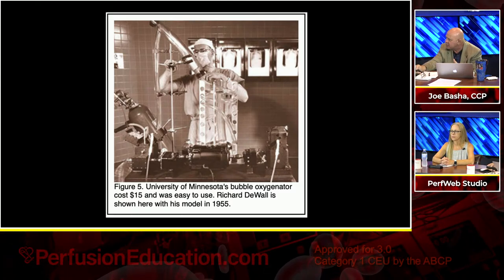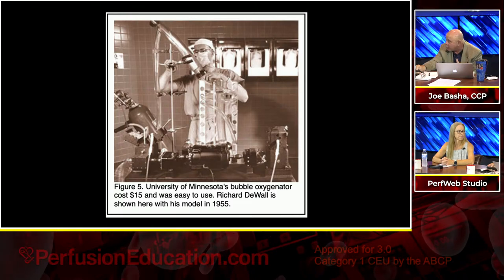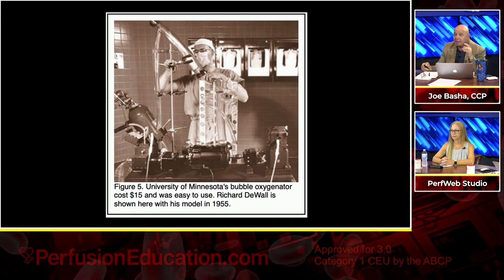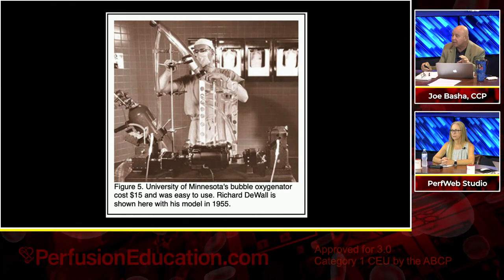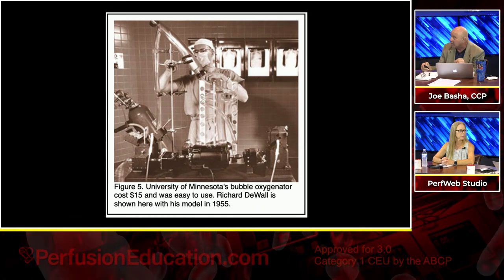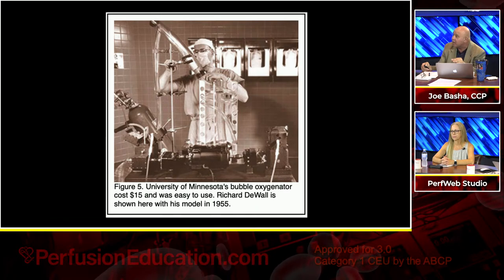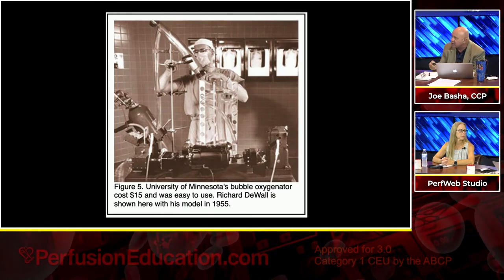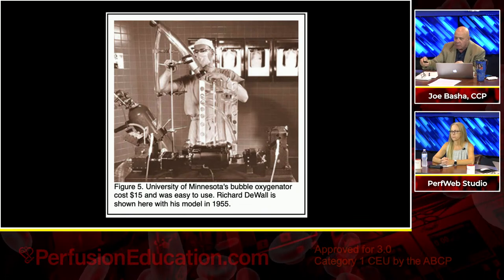But what was one of the big issues with bubble oxygenators? Well, bubbling the blood definitely transfers oxygen, but it causes air foam. Foam is bad in the arterial system, right? Mm-hmm. In fact, it's interesting that Dr. DeWall's foundation for developing the bubble oxygenator came from the 1800s, when they were bubbling air into veins to oxygenate. Now, it didn't work out well, but people knew already, even in the 1800s, that you could oxygenate blood by bubbling air into it. The problem, again, is that the foam doesn't work out too terribly well.